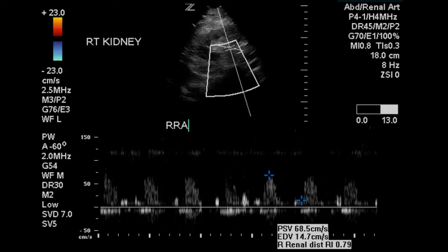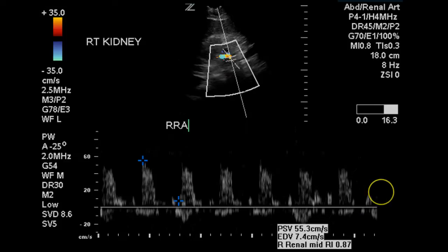Here is another image. This is the distal portion of the right renal artery. The velocity is 68.5 centimeters per second. It is difficult to determine whether the angle correction has been set in the right way. This is the mid portion of the right renal artery, and we get a velocity of 55.3 centimeters per second.